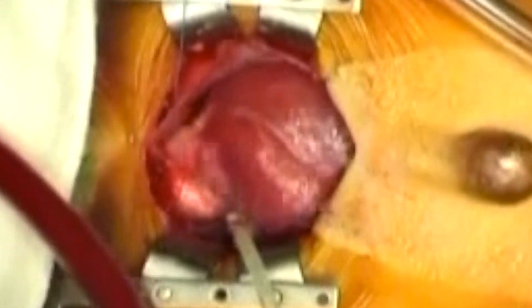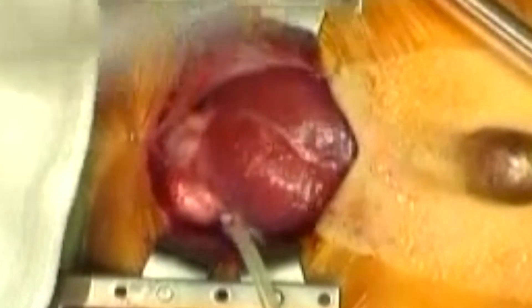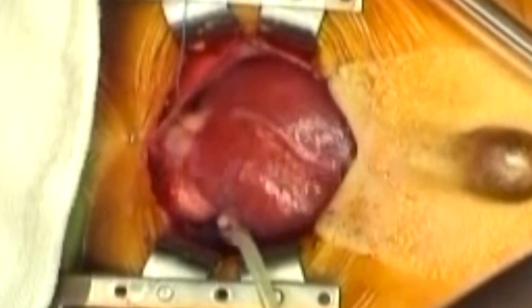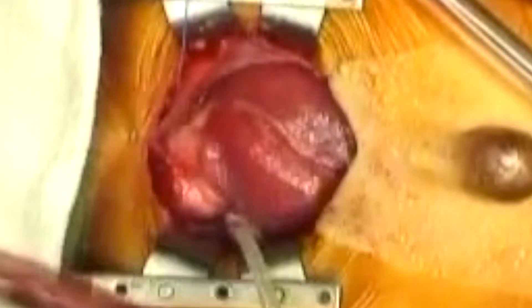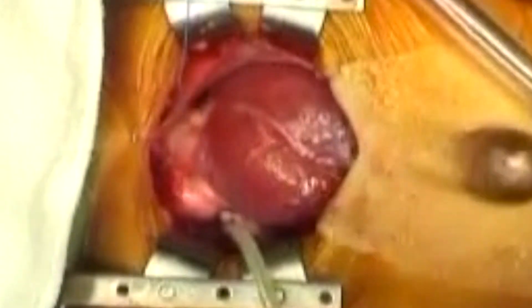Below the left anterior descending artery in the picture are the pulsations of the patient's right ventricle and right ventricular outflow tract. Of note is the abnormal course of the left anterior descending artery, running roughly from top left down to the bottom right in this picture.